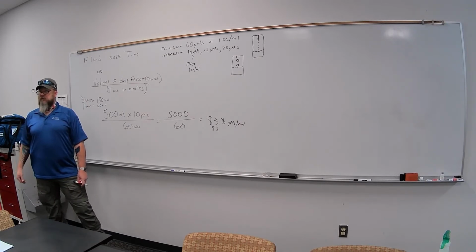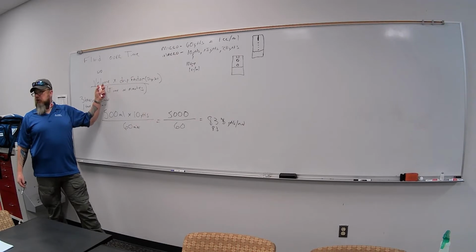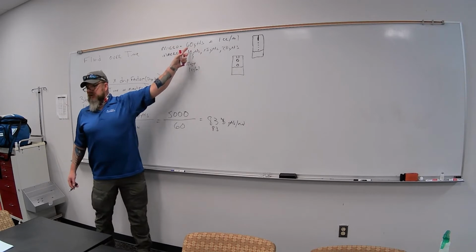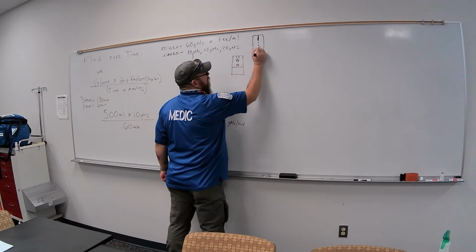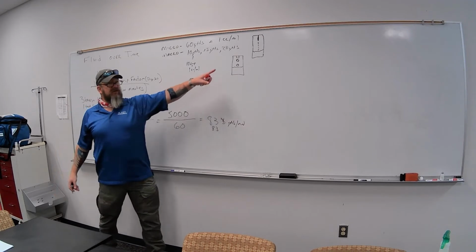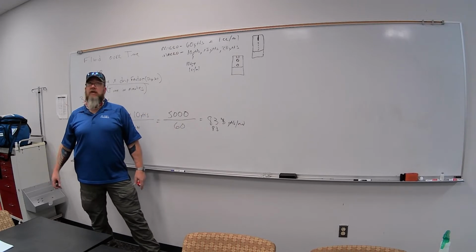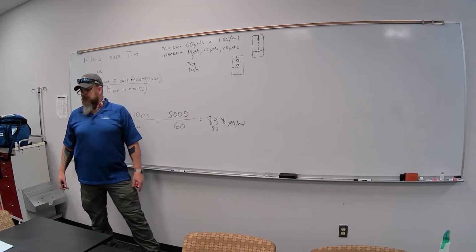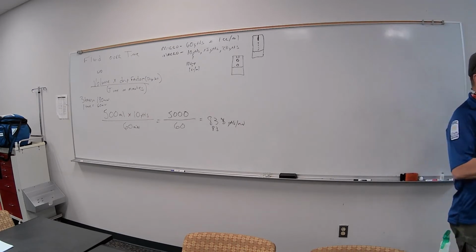Now some things, it doesn't make sense. Okay? If you're trying to give a large volume, okay, I wouldn't want to give it in a 60 drop set. You can't count it. These drops are so small and so fast. Because if you wanted to do this in a 60 drop set, you'd have to multiply this by 6. So it'd be 498 drops per minute. Can you count that fast? I can't. Okay?